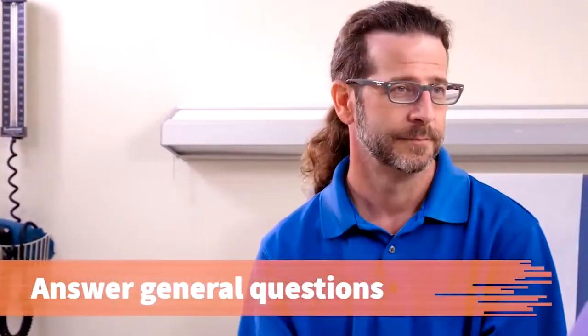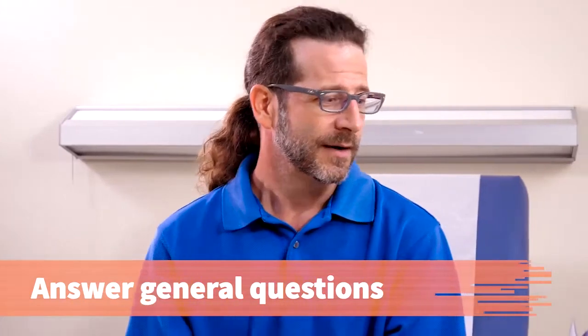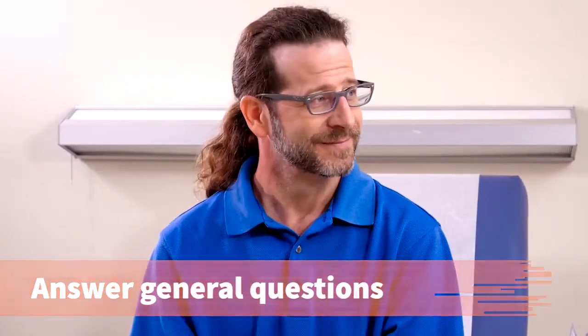All right. Dr. Smith would like for you to give us a stool sample. I'm going to go over everything with you, okay? Answer any general questions the patient may have about the collection procedures before you give detailed instructions. Do you have any questions before I get started?